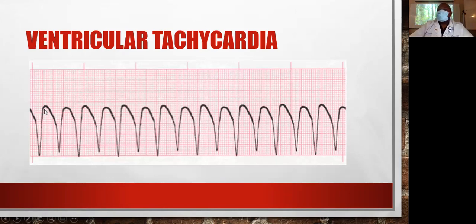You have no T wave, no P wave, nothing but the ventricle contracting, right? That is VTAC, one of your deadly rhythms.